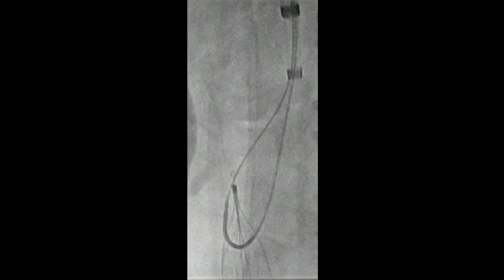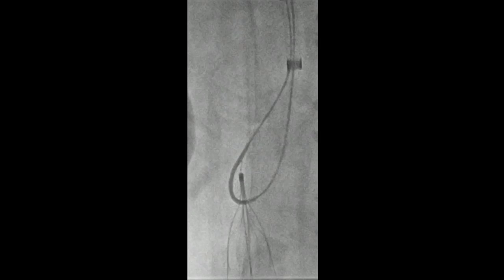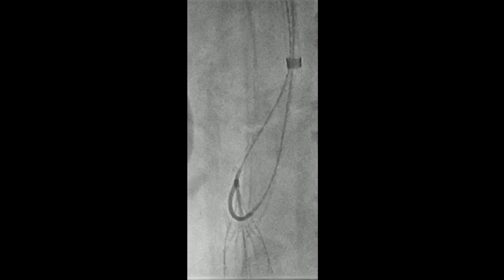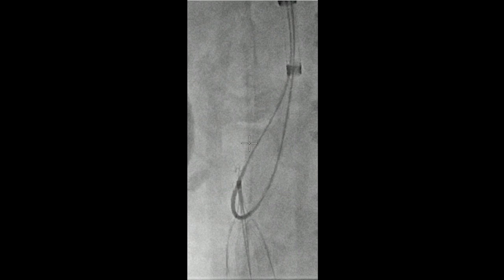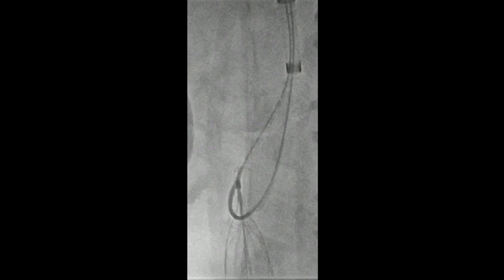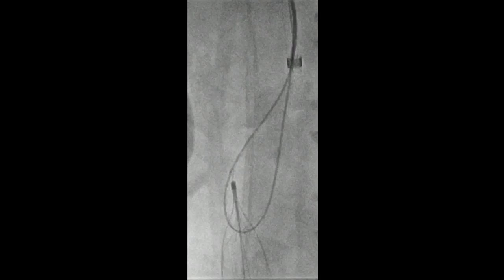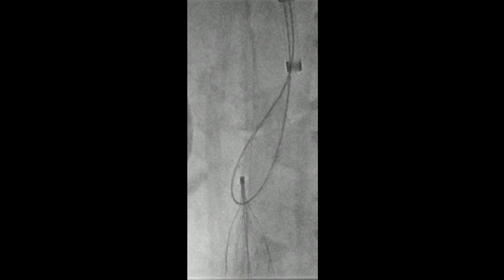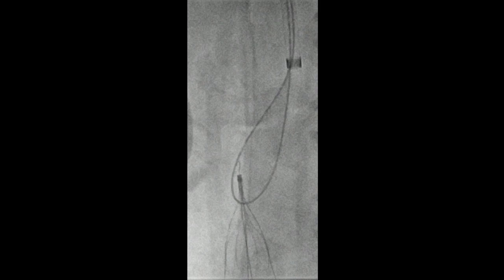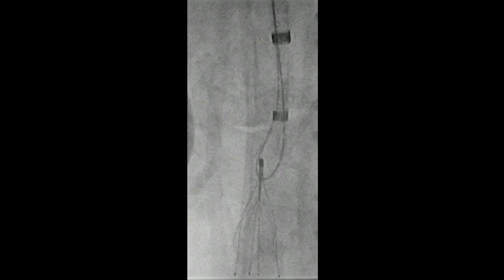What we've done now, as you can see, is we've exteriorized both ends of the wire, so we can put some tension on the wire superiorly and advance the sheath hopefully down towards the tip of the filter. You've got to use a 260 wire. We've exteriorized both ends so we've got a loop around this — that means we can pull up on it and attempt to pull the hook off the wall. Now we're taking the catheter out because we're going to replace it with a snare. We're pulling up, using the wire to direct towards the apex.